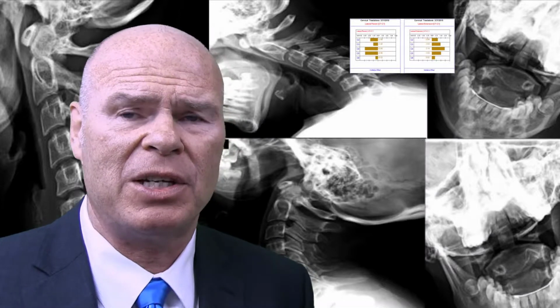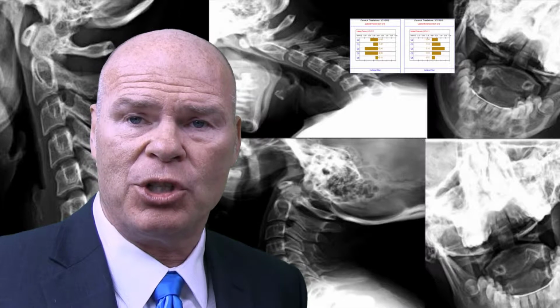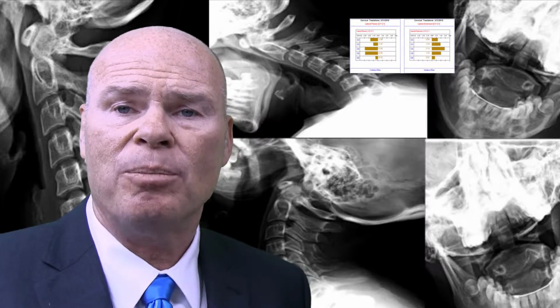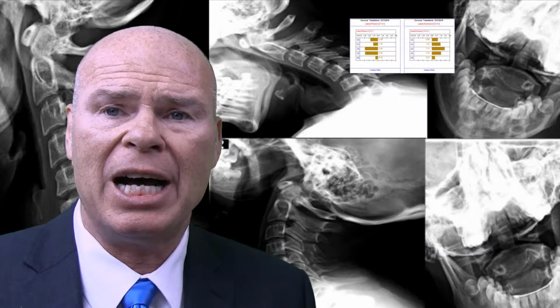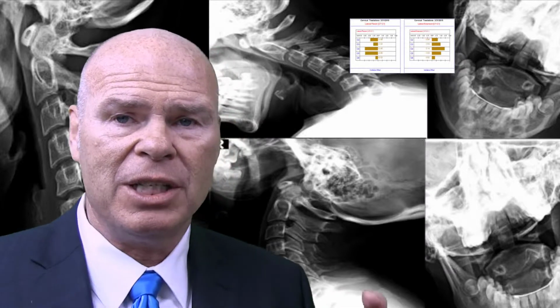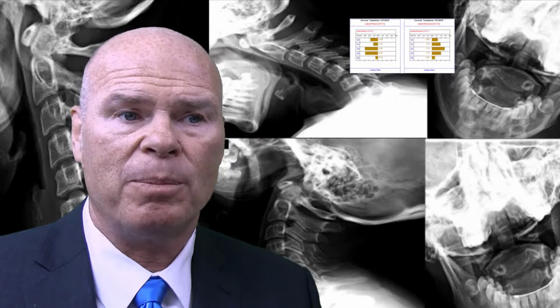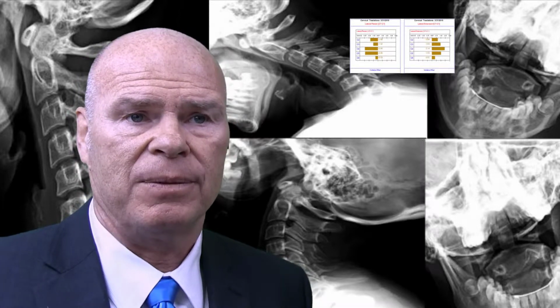Very, very simple concept. So when we have ligament damage, we know it causes excessive motion. And the amount of excessive motion in the spine, so simple stress radiology can show if a spine misaligns under stress, and that's called malmotion. It's most clearly determined on X-ray. Just like these guidelines say, not necessarily DMX at this point. These are X-ray guidelines. These are plain film, digital X-ray guidelines.